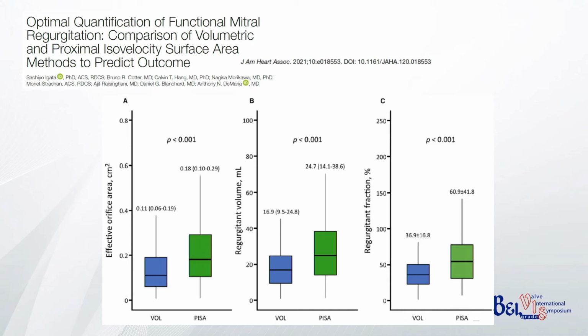These are the data that I've just found published online a few days ago, comparing measurements both done by echocardiography, but this part is based on PISA, and a part of the measurements in the same patients is based on volumetric methods.